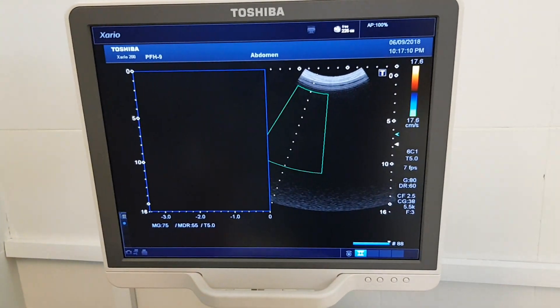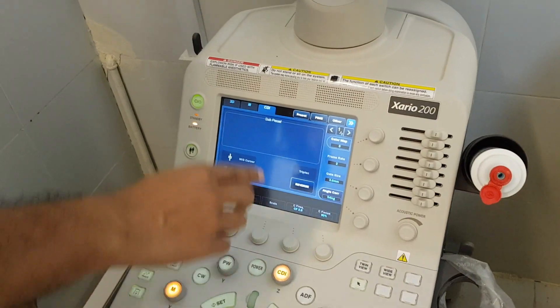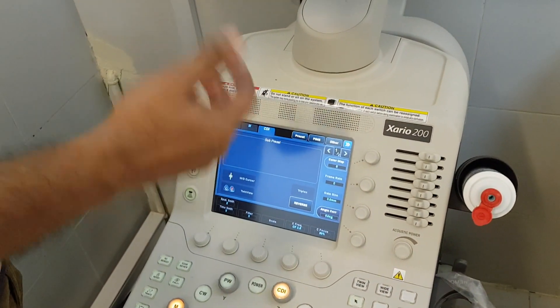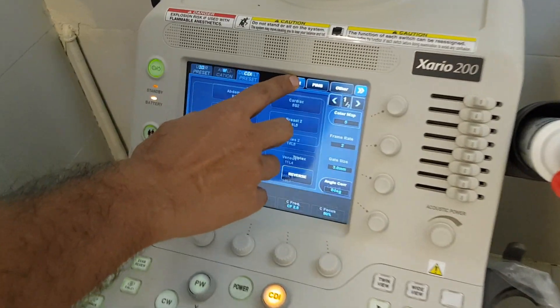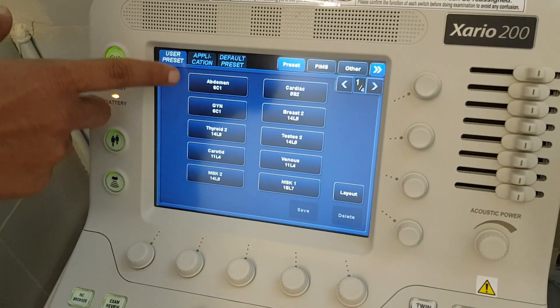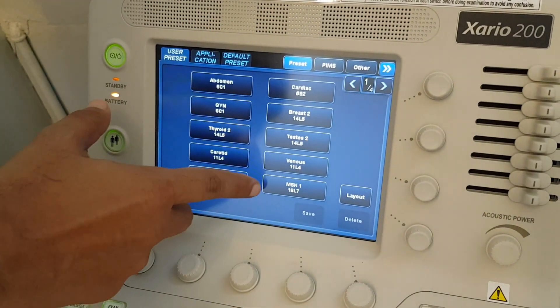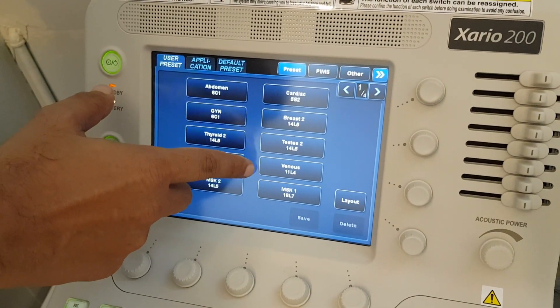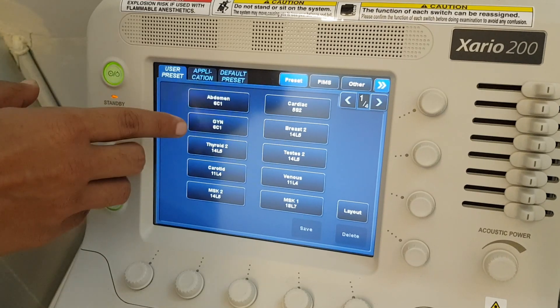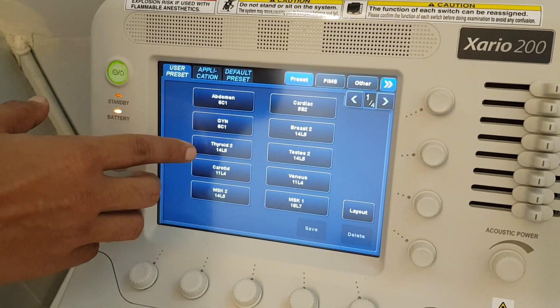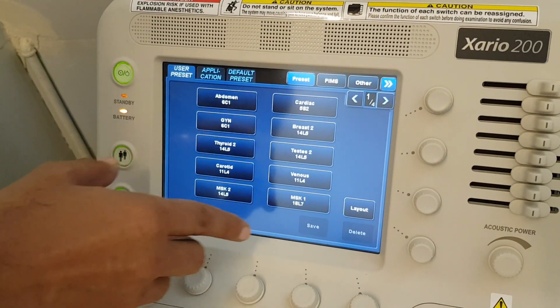But if you have an LCD on this machine, there is a menu button. If you press the preset button, you can see the same modules or pre-dedicated software instructions: abdomen, gynae, thyroid gland, carotid, and so forth.